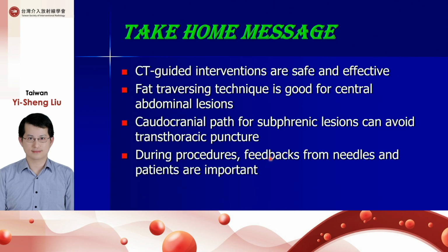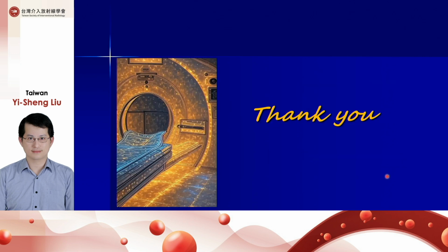So here is the take-home message. CT-guided interventions are safe and effective. Fat traversing technique is good for central abdominal lesions. Caudocranial paths for subphrenic lesions can avoid transthoracic puncture, and during procedures, feedback from both the needle and the patient is important. Thank you for listening.